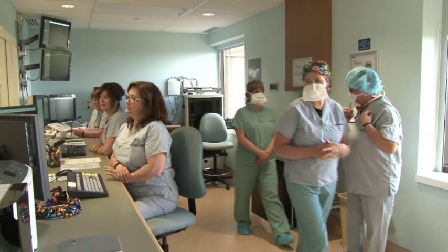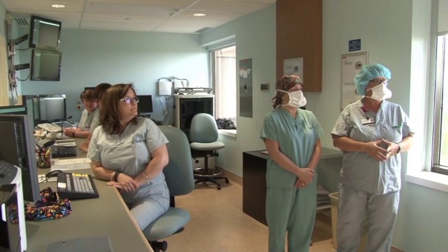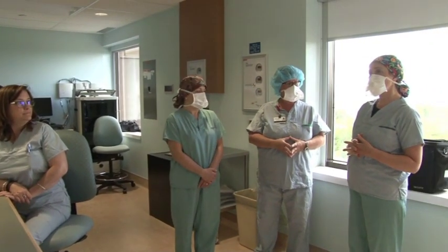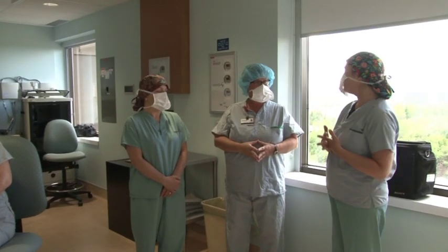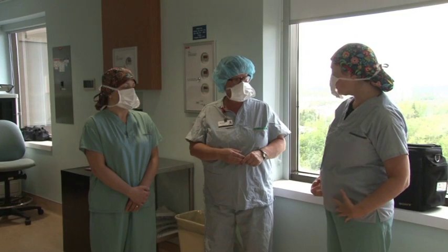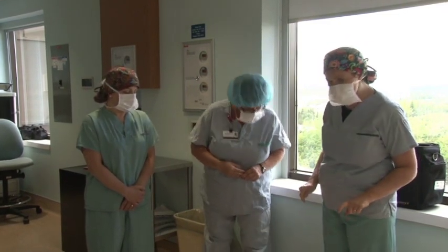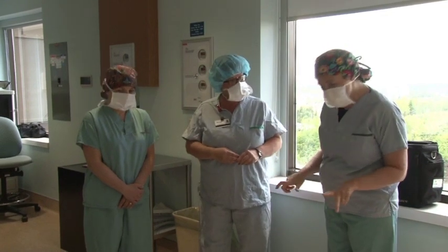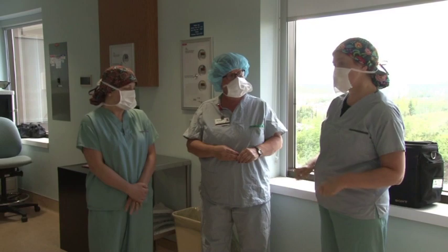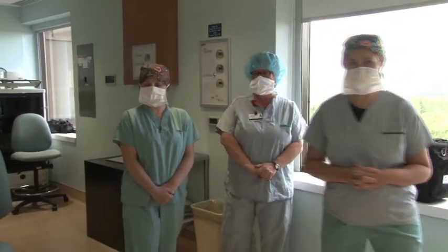Are we dressed okay? Do we need a lead or anything right now? So in regards to dress, this is a procedure room. We keep OR quality air, and to keep the room sterile and try to keep all the germs out, we are to wear OR greens, have masks on, cover our hair, and if you have shoes on that you wear outside, you need to have your shoes covered, but if they're shoes that are only used within the facility, those shoes are fine. Oh, perfect. Okay, so I think we're all set. We're all geared up.